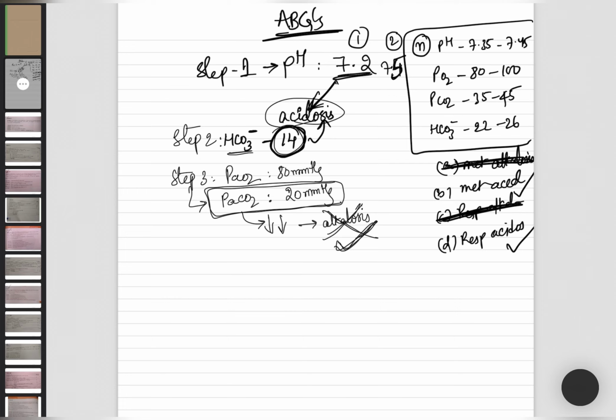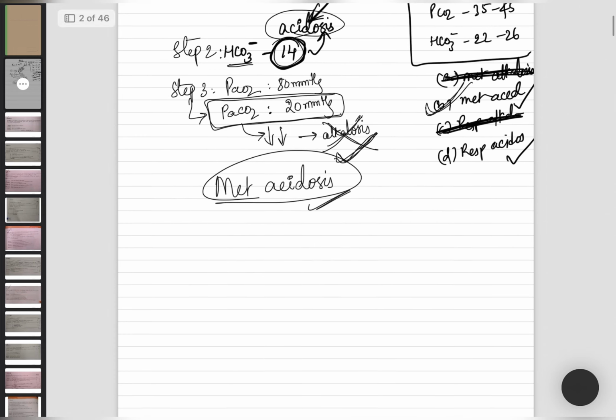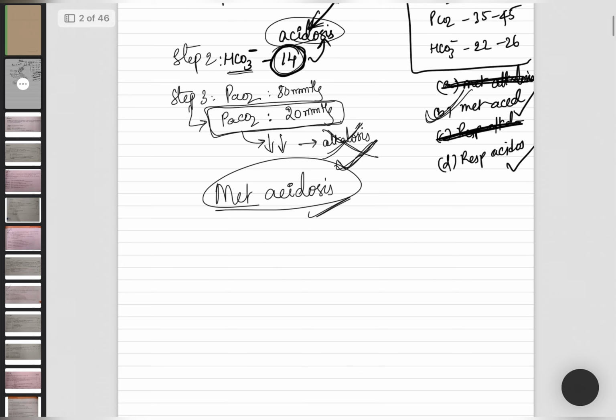I'll explain the compensations in a later video. Now if I explain, it becomes complicated. So here, this is pure metabolic acidosis. That's it. Compensations later, don't worry. You'll get to learn everything.